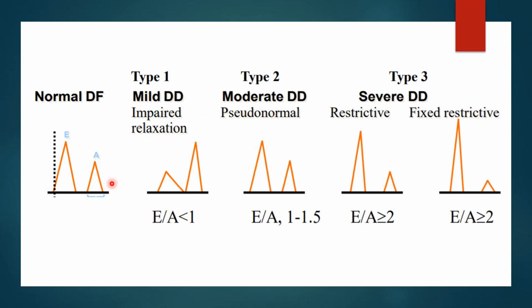So your normal mitral pattern is you have an E wave, but basically as the filling pressures in your left atrium rise, as the left atrial pressure goes beyond the left ventricular pressure, because you remember during diastolic phase, your left ventricle is relaxing, your left atrium is filling, and as the pressure in your left atrium rises above your left ventricle, your mitral valve opens, and this blood velocity representation is what you get as your mitral valve initially opens: your E wave.